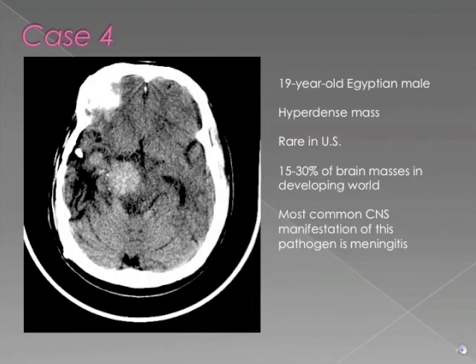In Case 4, we have an axial CT image from a 19-year-old Egyptian male who presents with a hyperdense mass in the right basal ganglia. This disease is rare in the United States, but is responsible for up to one-third of brain masses in the developing world. The most common CNS manifestation of this pathogen is meningitis. This is a case of tuberculosis resulting in a tuberculoma.